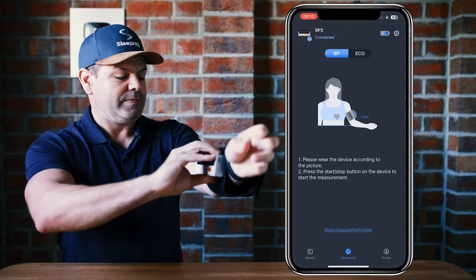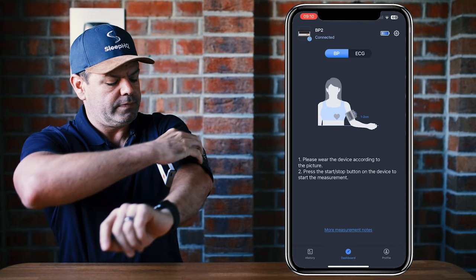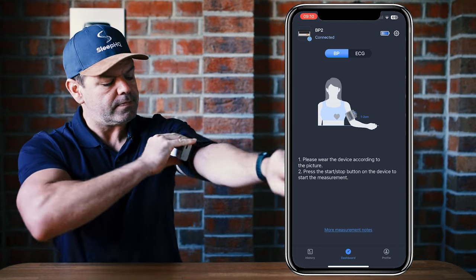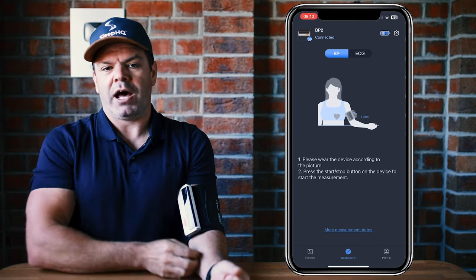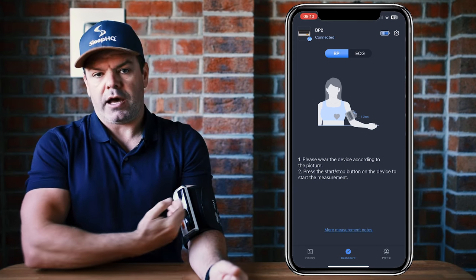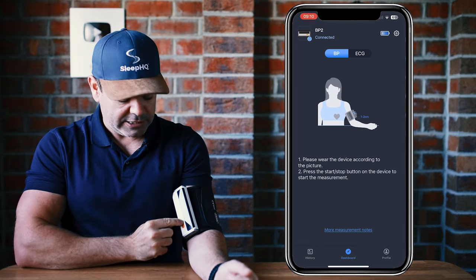Slide the cuff up over your arm — you can adjust the Velcro tension if you want. Sit down and rest your arm on a nice flat surface so that the cuff is ideally around your heart level. Then just click start.